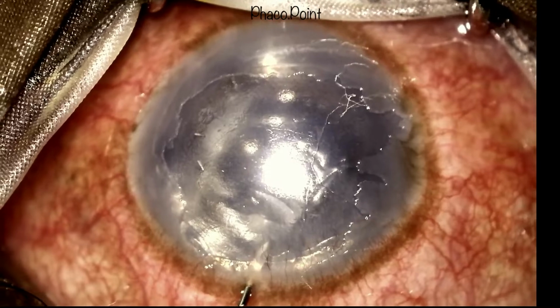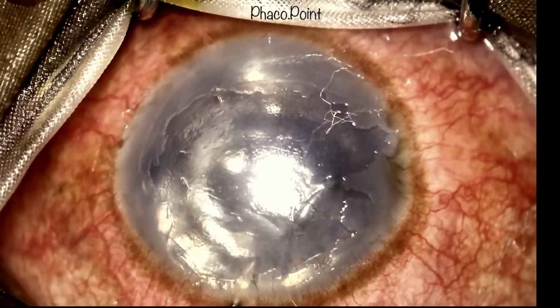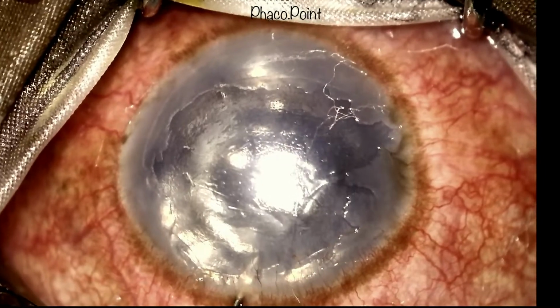As the endothelial cells on the reattached Descemet's start to function, watch how the cornea clears even more.